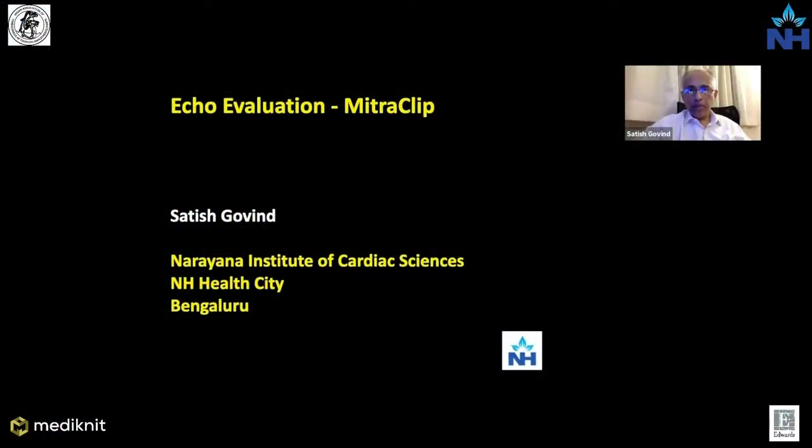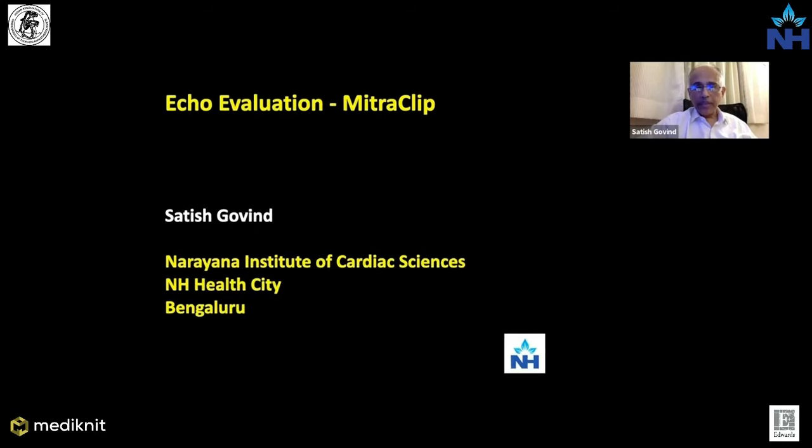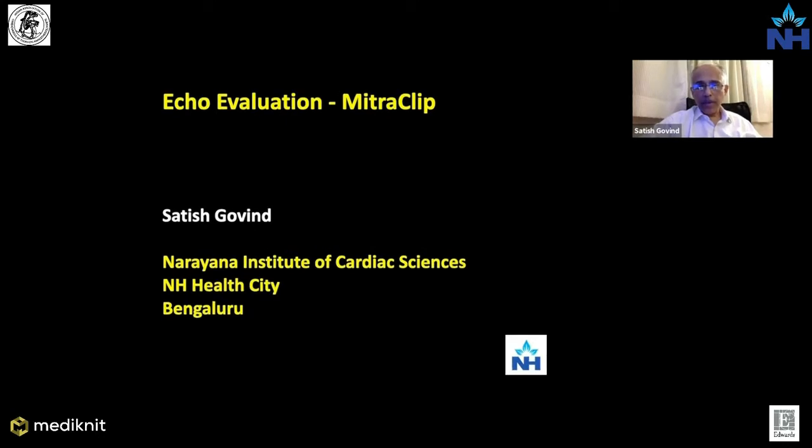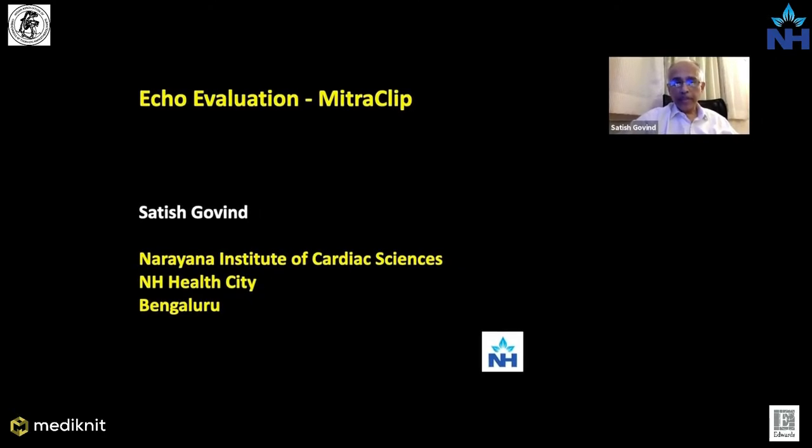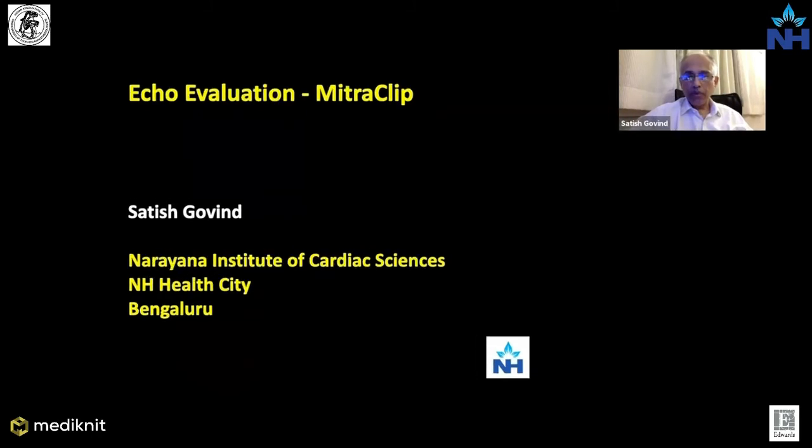Today, my talk will be on Mitraclip, a transcatheter intervention which has come to India recently, and there's a lot of interest in this about how to tackle mitral regurgitation. So my focus is on how does one evaluate these patients who may be eligible for Mitraclip.